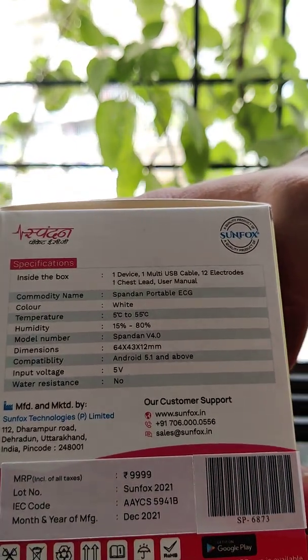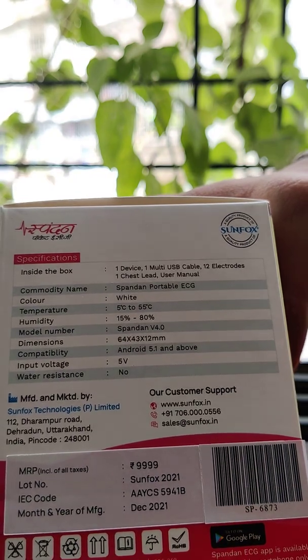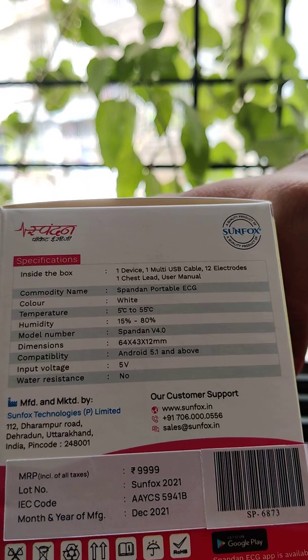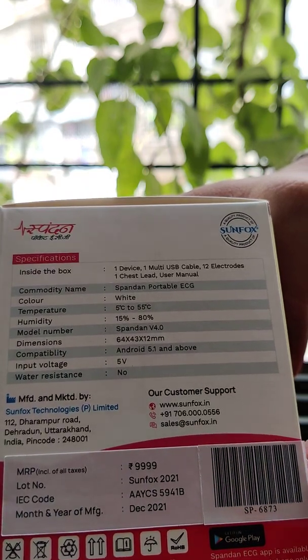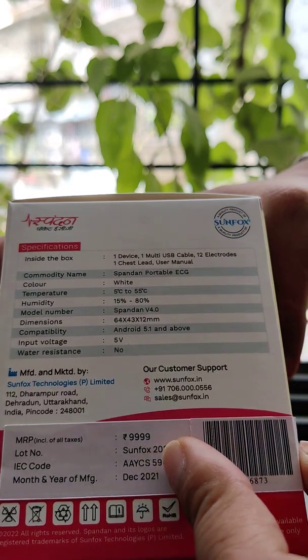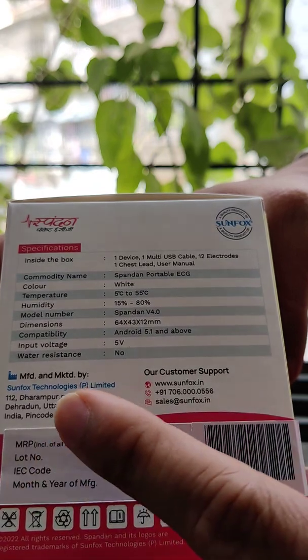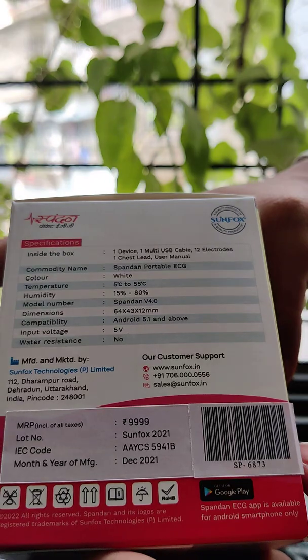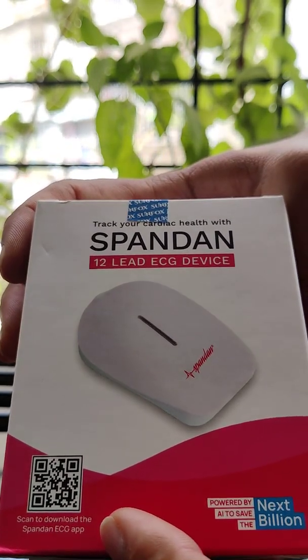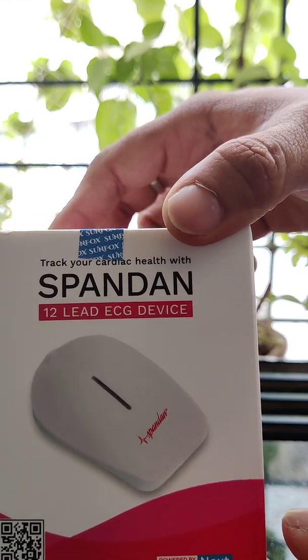Looking at the specifications: you get the device itself, one multi USB cable, 12 electrodes, one chest lead, and a user manual. It is a white colored portable ECG device that can operate in a temperature range of 5°C to 55°C, so it has a wide usable range. The price on the box is listed as ₹9,999, but I got it from the website for around ₹7,500. They also have a special app — the Spandan ECG application — which you can download from the Google Play Store.